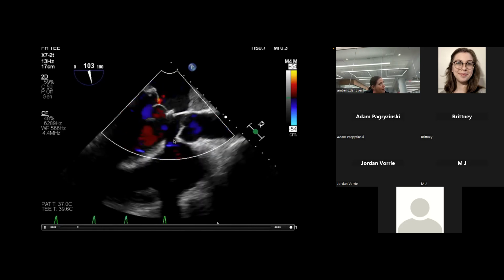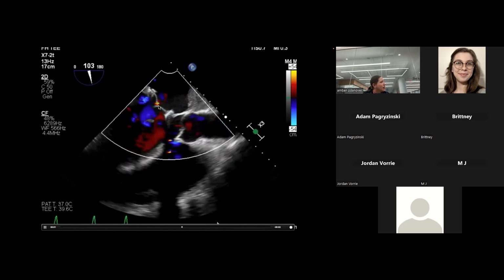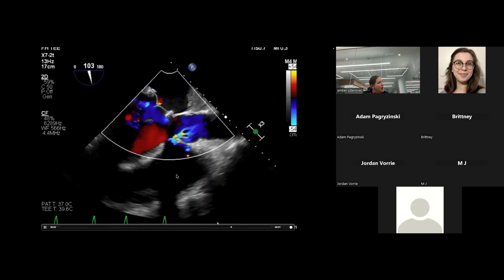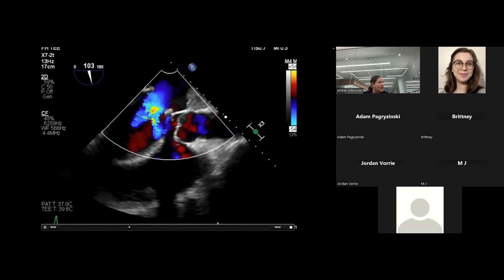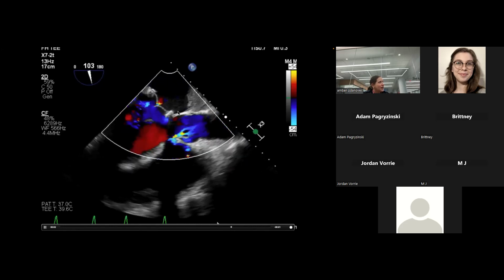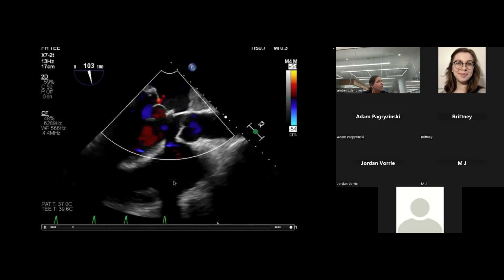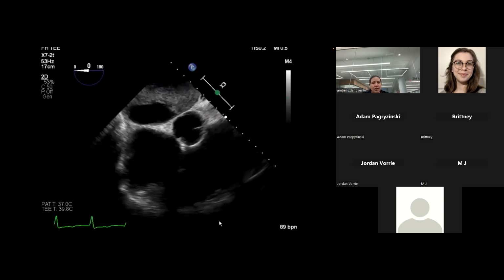This is the two view or the... It's more in a long axis view, I would say, even though you're only at 103. RV underneath. Or maybe the VSD is. Maybe. You're not getting color flow, and remember you're getting this dropout artifact from this strut right here, right? So this is a really shiny, reflective material, and the ultrasound beams probably aren't getting past that. But something you'd want to interrogate in other views. Okay. We're gonna keep going.